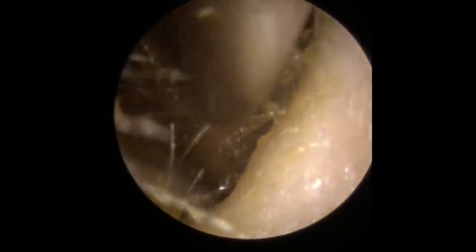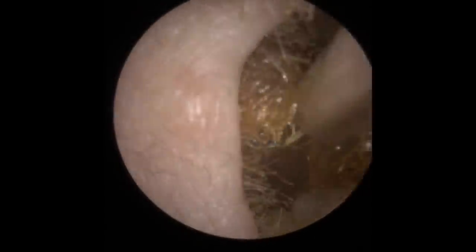Just going in now to get the next piece. So you see quite a large piece of wax now come to the outer part of the ear canal. Little bits broken off it there. We'll just flush that through with a little bit of water. There we go. Sorry, flush the suction tube through with a little bit of water, not the ear.